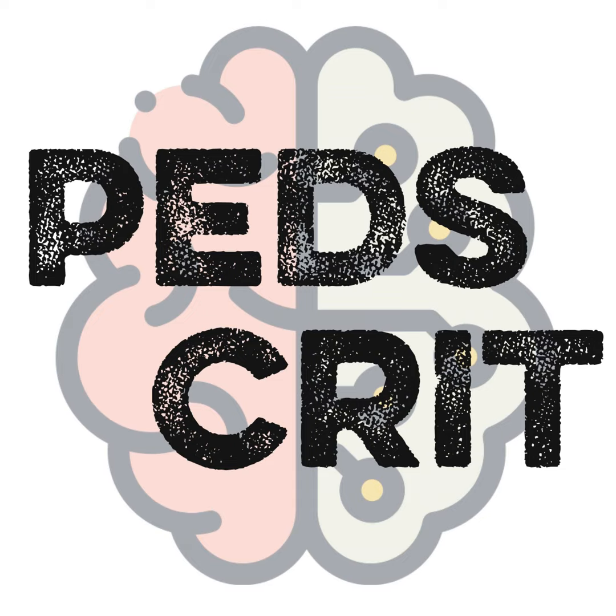That gets at your second thing, okay? I'm cognizant of driving pressure. I'm cognizant of PIP and plateaus if I'm in that mode, but mostly PIP, okay? In most of the pressure-controlled decelerating flow modes that we use, I'm cognizant of those numbers, okay? But I don't prioritize them. It's actually FiO2 that I'm prioritizing while I'm keeping PIP low enough. And driving pressure just ends up being the resultant variable of me prioritizing FiO2 and keeping my PIP good enough. You see what I'm saying? But it's not actually something I'm aiming toward. Power, I'm also aware of, but I'm not calculating toward.